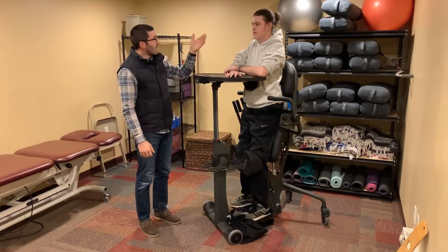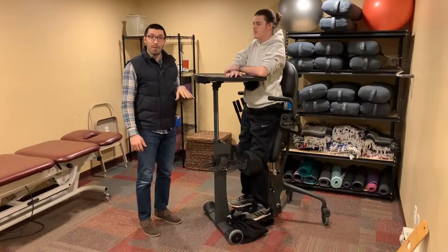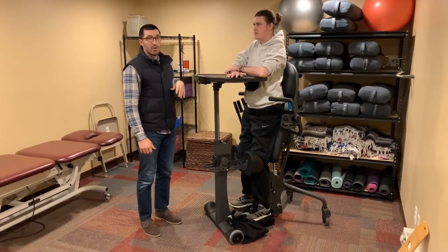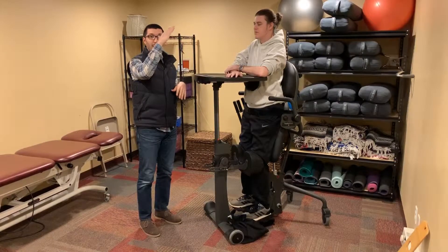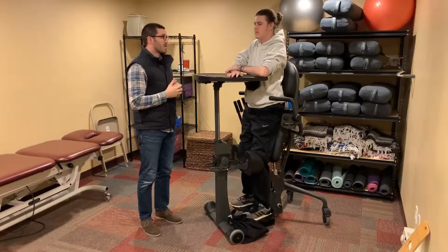In Trev's case, we had blood pressure dropping when he would go into a standing position, so we started out using a tilt table where we could take him incrementally up into this upright position.